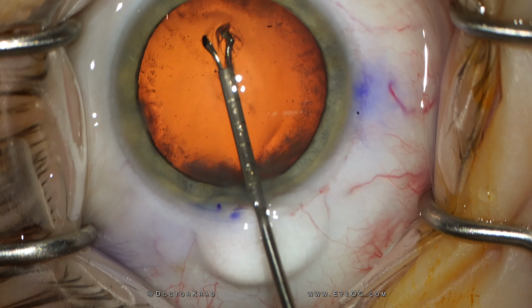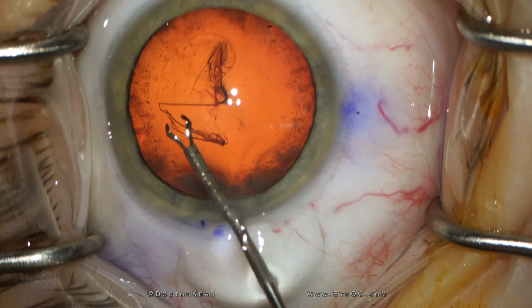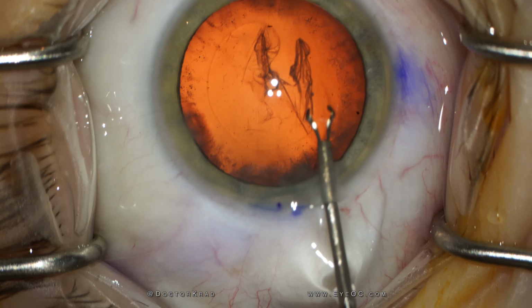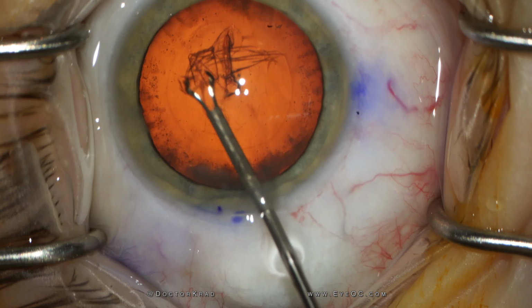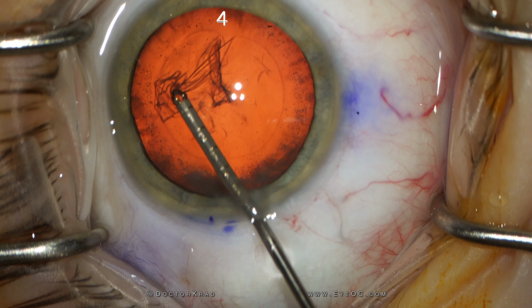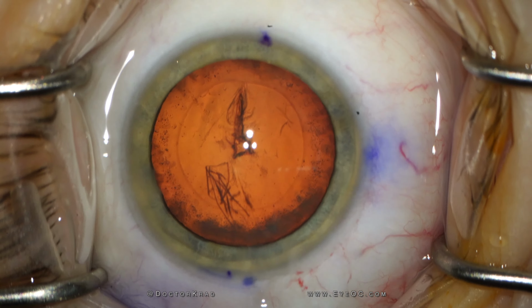And the reason I think this works for me is because it breaks down the RHEXIS into 4 different parts. And anytime you take something complex and break it up into simple steps, it makes it easier. It's like when Ike Ahmed says that complexity is simplicity multiplied or something like that. I probably butchered it, but you know what I mean. So I don't focus on 12 points or 8 points, just 4.